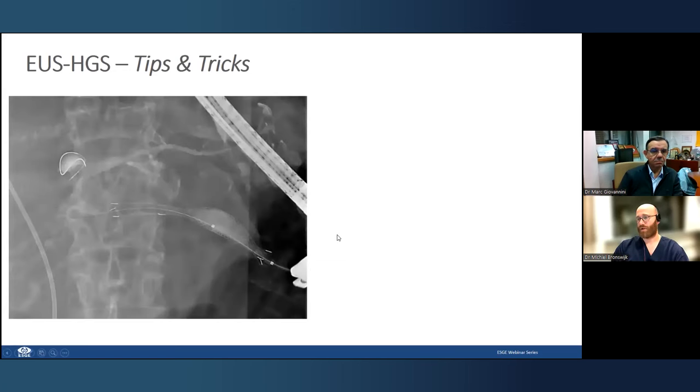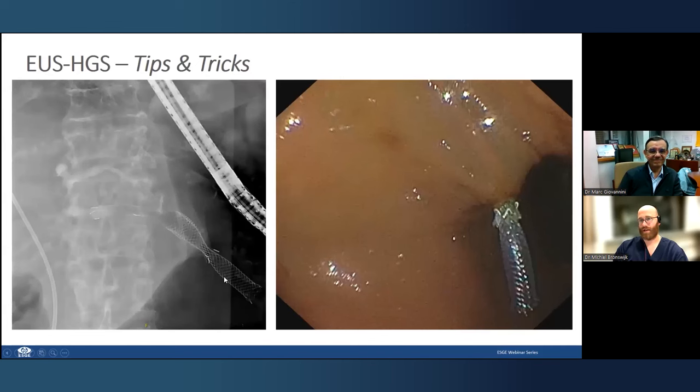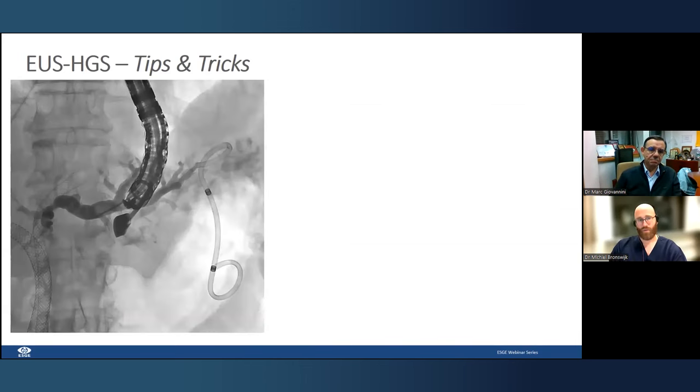But what we did see during deployment is that a large part of our stent was expanding inside the intraperitoneal cavity. This is more or less a candy wrapper sign, and you really have to take care with this location. So always take care to leave your guide wire in place in these indications. Don't lose it, and you see here the stent just hanging on by a thread. Use the guide wire to perform a bridging stent. So here we placed a fully covered stent inside to reduce the risk of stent dislocation. What we definitely do not want to see are stent dislocations.